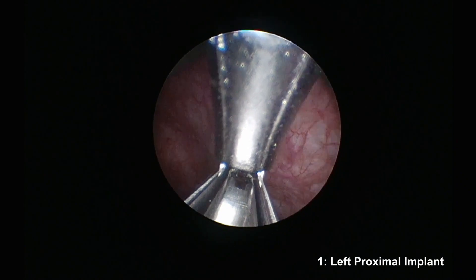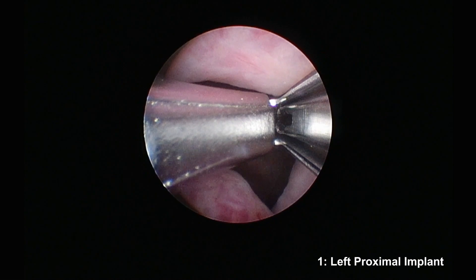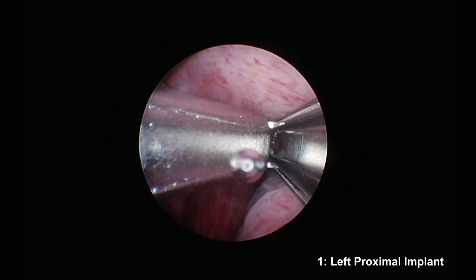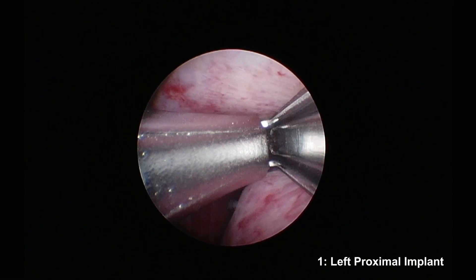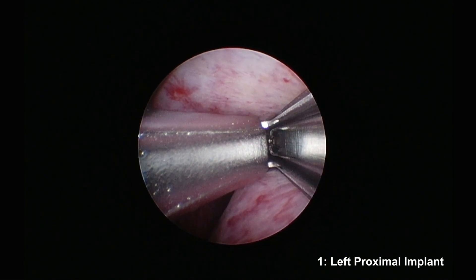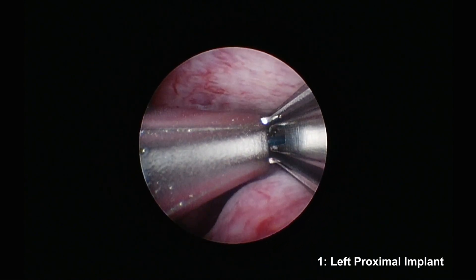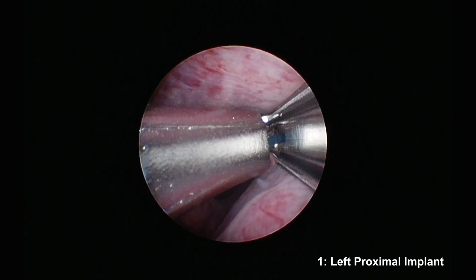I begin by placing the proximal lateral lobe implants using the UL-2. With the device tip in the bladder, I rotate the device to treat the left lobe first. Starting with the keyhole at the bladder neck and then moving distal 1.5 cm allows me to confidently treat the proximal tissue. I create an anterior channel by keeping the device tip in the anterior one-third of the gland. Angling the implant deployment to either 2 or 10 o'clock helps me maximize the anterior lift. This is a key planning step in OML cases. I think of it as raising the roof.